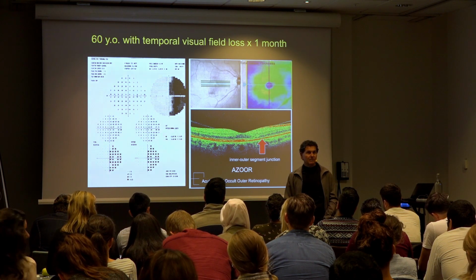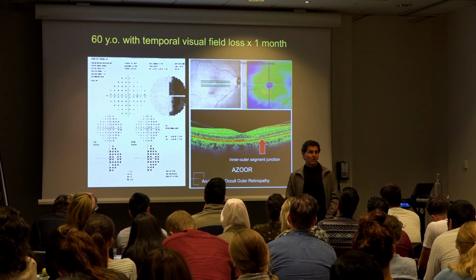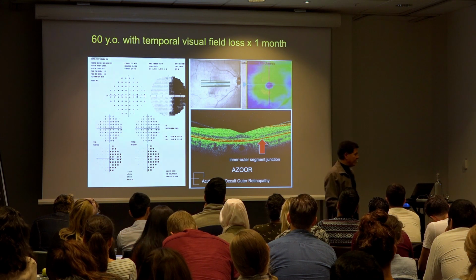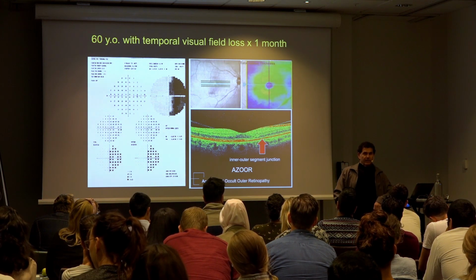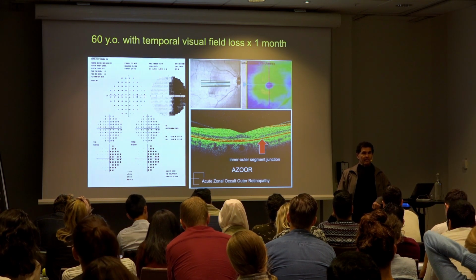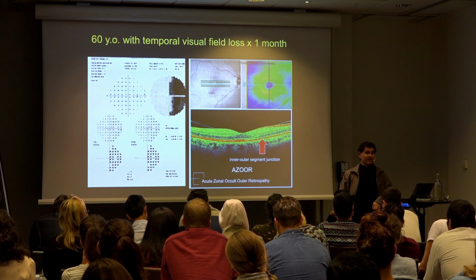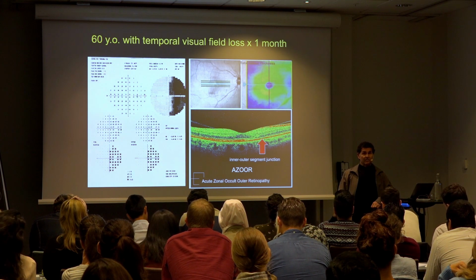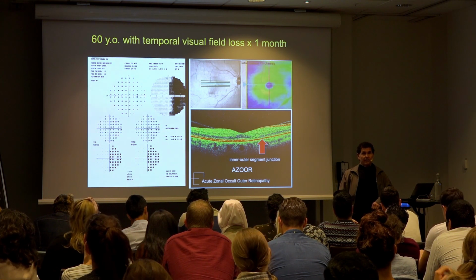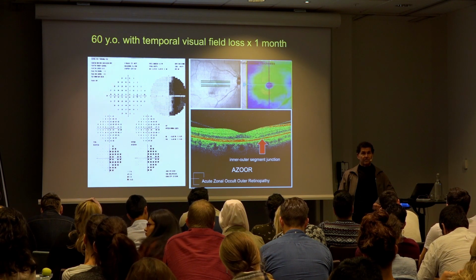Is it really wrong to do an MRI of the optic nerve here? Because maybe a compression there could cause the retina changes. So we're going to go over this with some of the other cases, but you get retrograde degeneration into the inner retina, but you don't get transsynaptic degeneration into the outer retina. Yeah. And also the inner retina had a normal thickness here. So that's a good point to bring up, is that no, you don't get outer retinal thinning from a pregeniculate or a postgeniculate lesion. Good.